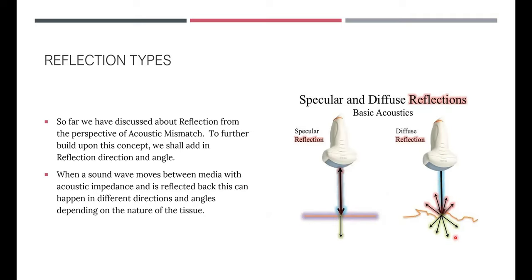But if you look at B lines in particular, what you've classically got is the concept of diffuse reflection. Now, the more you have in terms of interstitial fluid and bubbles and tetrahedrons, and I'll explain that, the worse the diffuse reflection. And the diffuse reflection then produces areas of internal reflection and refraction, which then produces what we call reverberations within the tissue. And it is this reverberation that actually ends up producing what we call the B-line artifacts, if they are vertical.